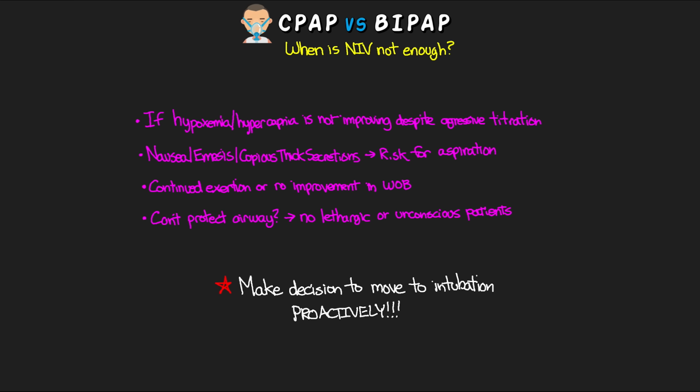I really hope this helped to explain the difference between these two different types of non-invasive ventilation, our CPAP and our BiPAP, and really give you guys a good understanding of what these differences are and why we would use one over the other for our patient.